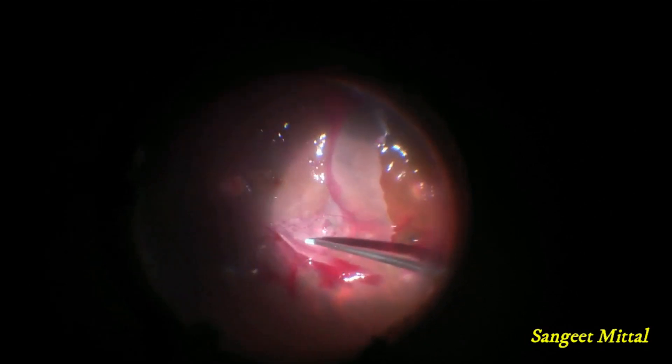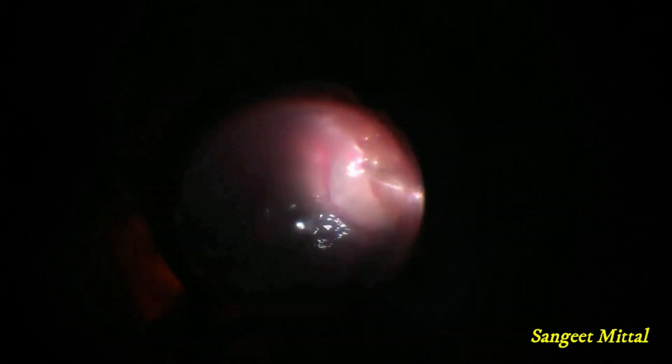The fold on the retina was straightened using a soft tip back flush. Endolaser was applied around retinal breaks, and a 360-degree barrage laser was done to the peripheral retina.